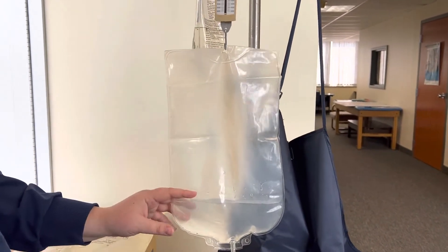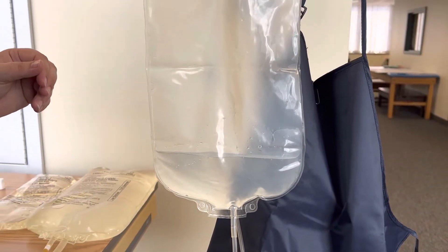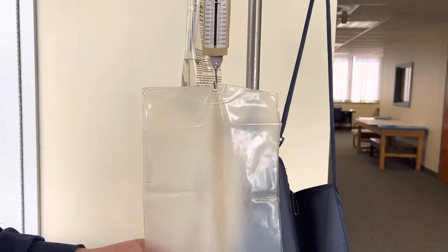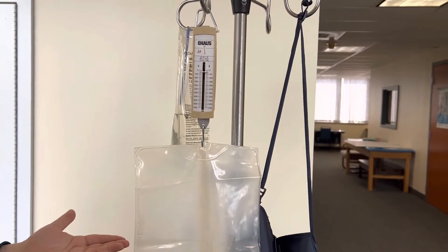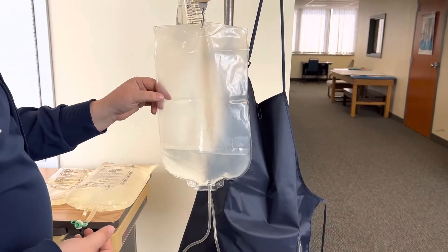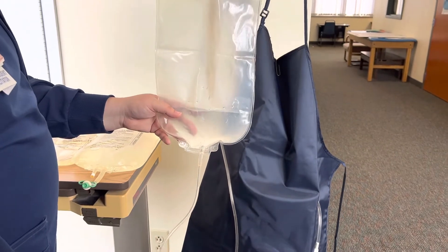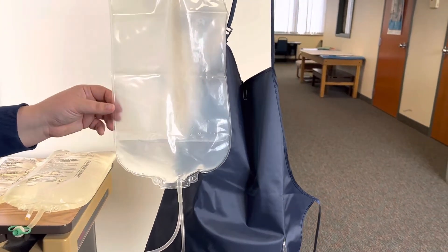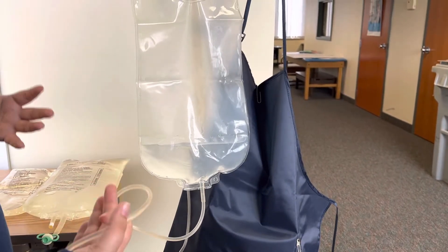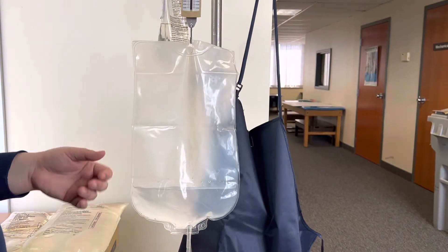Sometimes if you're not getting a lot of output, changing positions with the patient might help — sometimes they need to sit up or sit on their side. If the numbers are not quite equal or not even close, make sure you're repositioning the patient. On a rare occasion you may have a little less output, but you should not have a significantly less amount than what you previously put in.